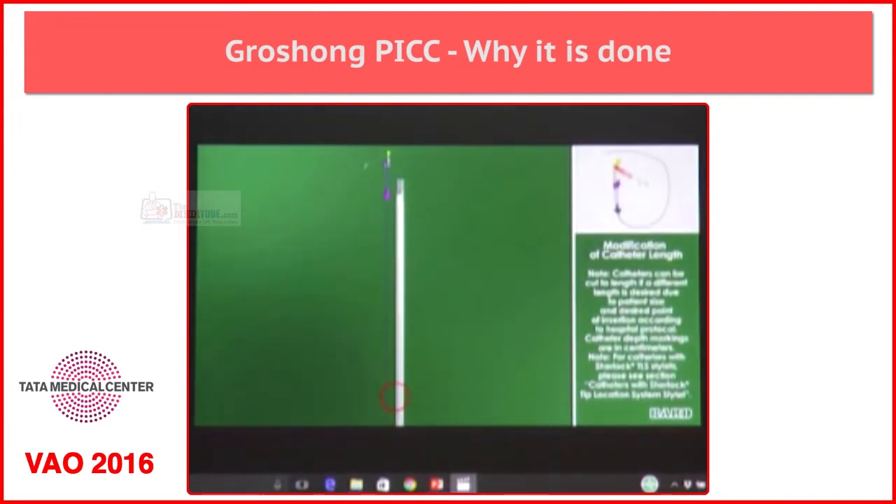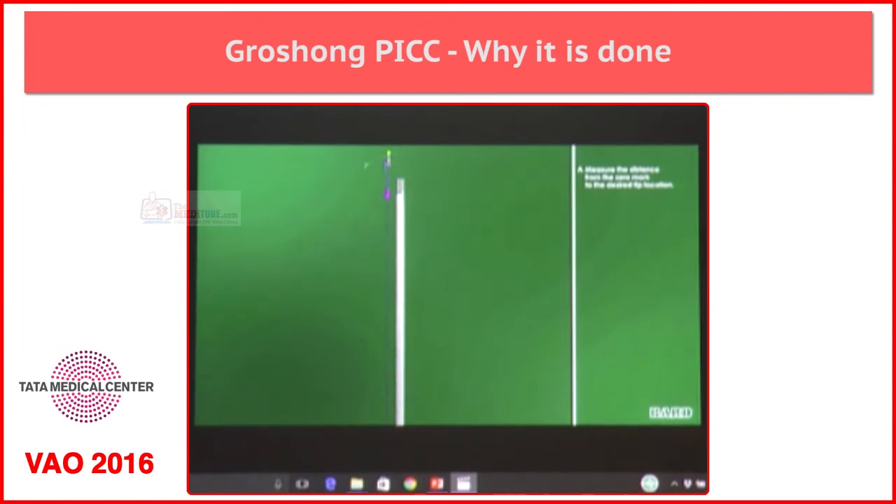Our Power PICC is a non-valved catheter, so we can trim it, and before the placement itself we have to trim it.